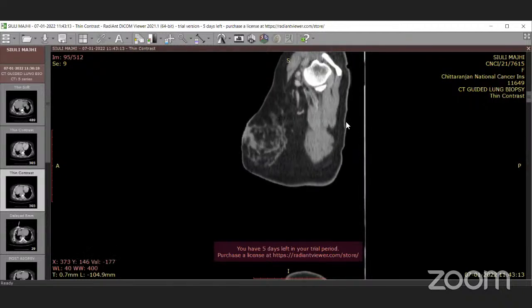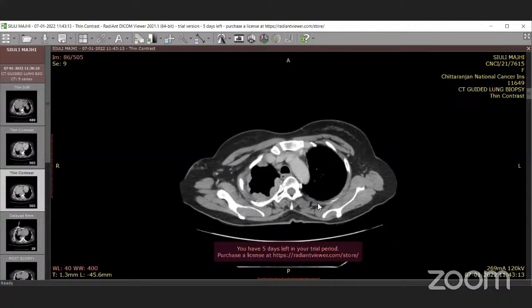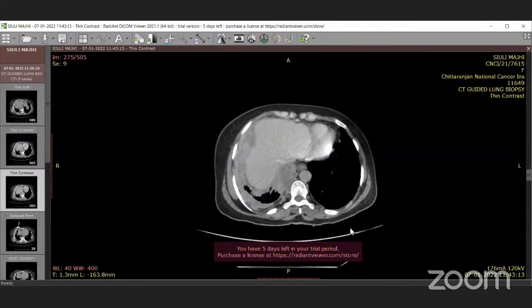So next we move to the serratus anterior. Yeah, give me a minute. So the serratus anterior muscle is better delineated because of the latissimus dorsi. So we first check, this is the latissimus dorsi, the outer and the posterior most muscle. So any muscle that comes anterior to this, on the outer and anterior and lateral portion of the chest wall, is the serratus anterior.